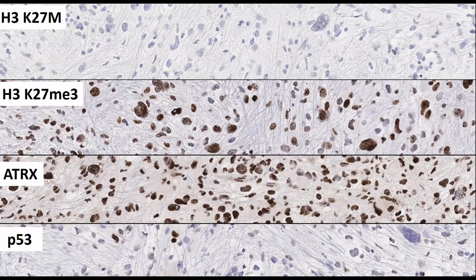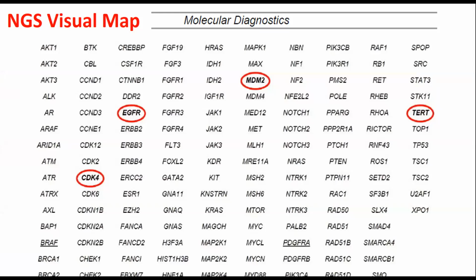That's number one. And secondly, that the pathologist knows that if there's no staining, is that normal or abnormal? If there is staining, is that normal or abnormal? And it works all four ways for both normal and abnormal. You have to understand what the antibody is directed against and what the biology is behind it, okay?